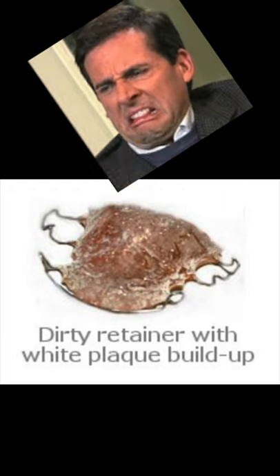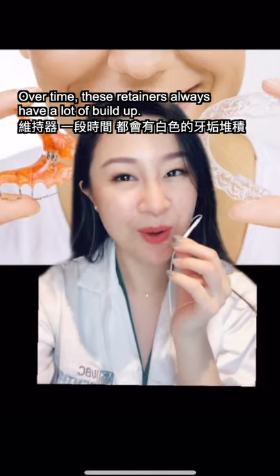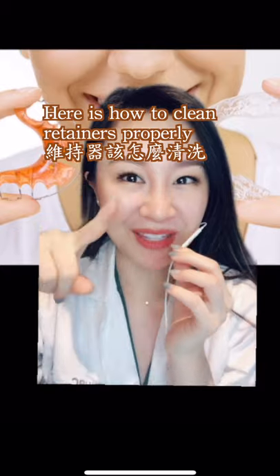Does your retainer look like this? Or maybe like this one? Over time, these retainers always have a lot of build up. Rinsing them underwater simply just won't cut it. Here is how you can clean them properly.